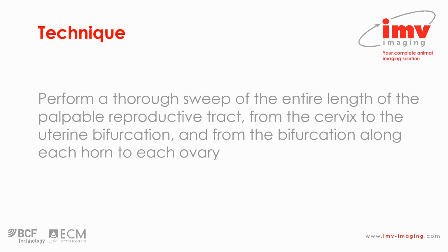The key is to make sure that you have been thorough in the way you've done it, and that you can be sure when you finish that you have seen the entirety of the reproductive tract, or if you physically cannot, that you make some note that you haven't seen the whole thing.